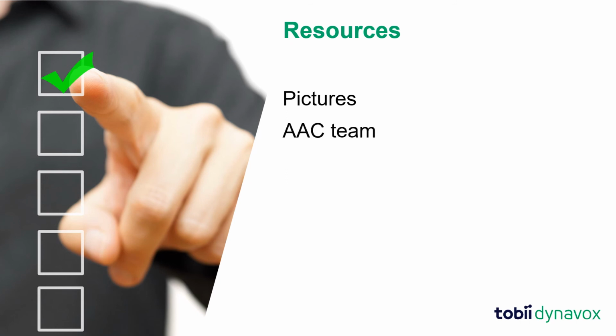Make use of your AAC team, which can comprise an occupational therapist, physical therapist, speech and language pathologist, vendor, educators, and of course the parents and guardians. Information gathered from these sources is critical to the use of the AAC device and to selecting the best mount. Your OT, PT, and SLP can determine optimal positioning for the AAC device and help with questions about access methods.